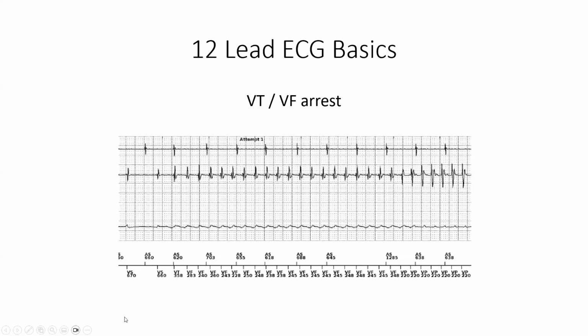I don't imagine or expect that this is something that you would see or read very often, but I can tell you that this is a normal beat here. So backing up, this is the atrial channel. We see the atrial activity up here. This is the ventricular channel down here. This down here is a shock lead, or something that's a discriminator that basically helps the device to differentiate between atrial and ventricular arrhythmias. But he's in a normal rhythm.